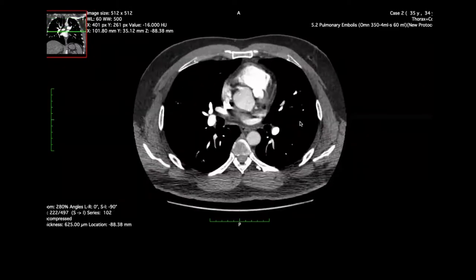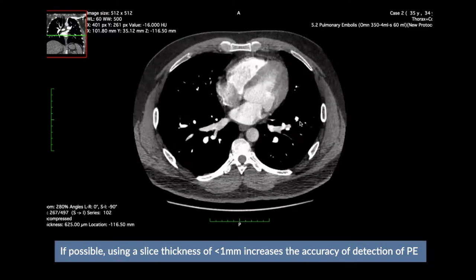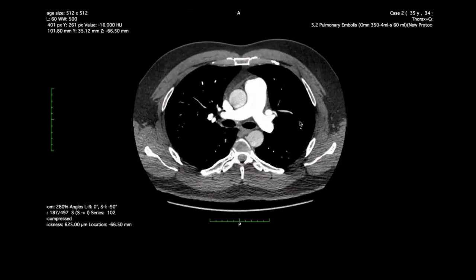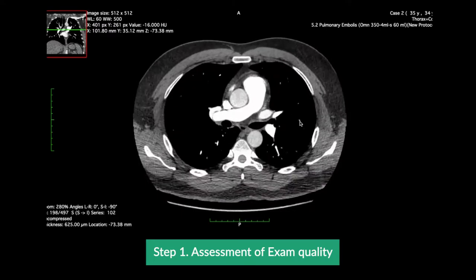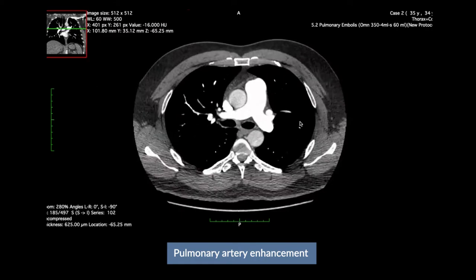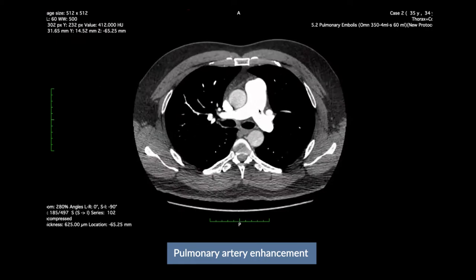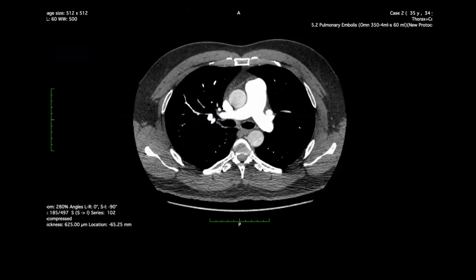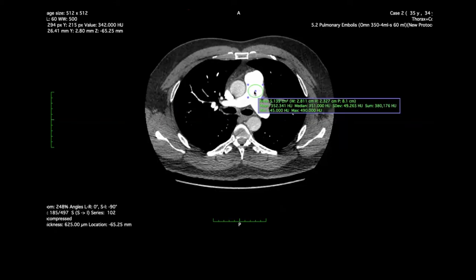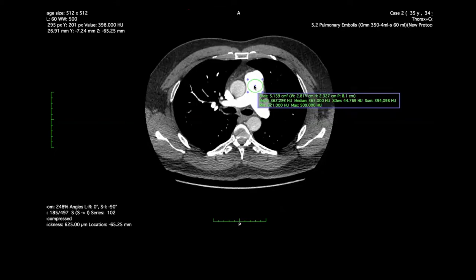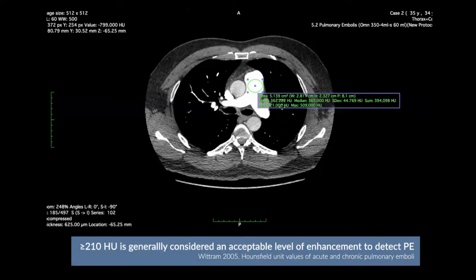Here we have actual images from a CT pulmonary angiogram with a 0.625 mm slice thickness. Before we start interpretation, begin by assessing the overall exam quality. We can assess the adequacy of pulmonary arterial enhancement by looking at the contrast within the pulmonary arteries. Ideally, we're looking for high density contrast within the pulmonary arteries. If your viewer has capacity for attenuation measurements, we can draw a region of interest at the main pulmonary artery. Make sure the circle covers at least 50% of the diameter of the vessel. Generally, we're looking for a level of at least 210 Hounsfield units in the main pulmonary artery.